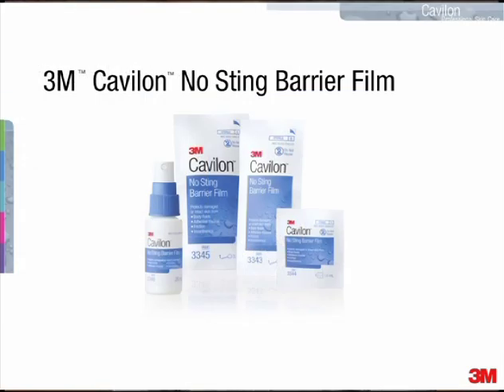Whenever you're using Cavilon No Sting Barrier Film, the first thing you want to do is cleanse the skin gently but thoroughly, and then pat it dry.